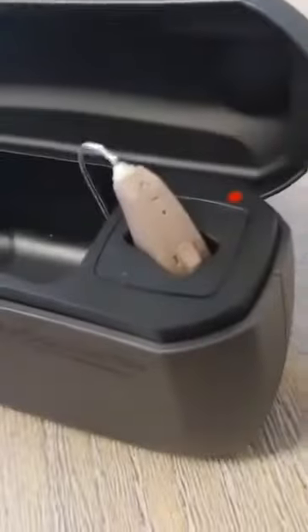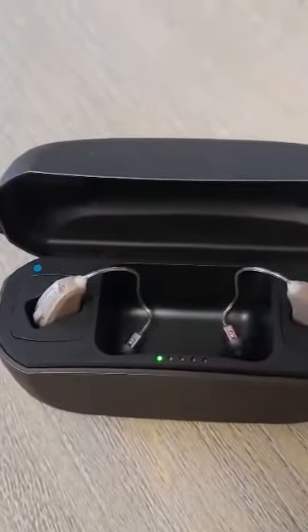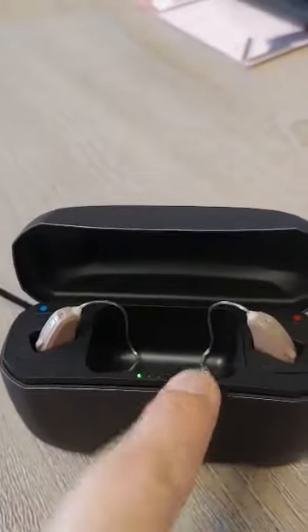The right one is red, so you'll line it up with the red dot on the charger, place it in here, make sure that it's blinking green. The wires just sit comfortably in the well there. It looks like this one is low charge as well, so we'll let it charge up all night.